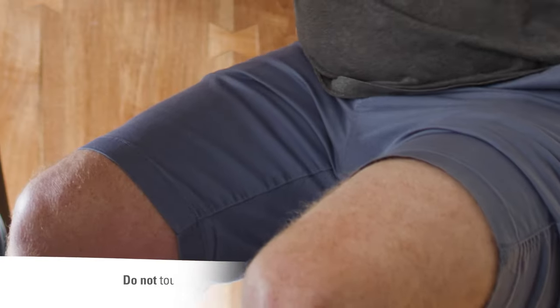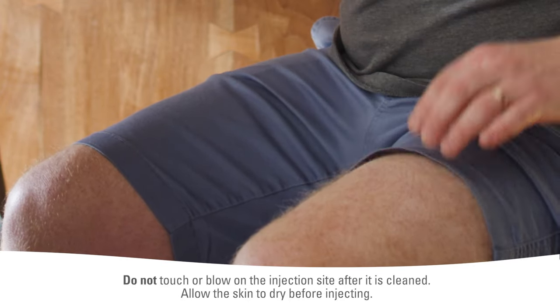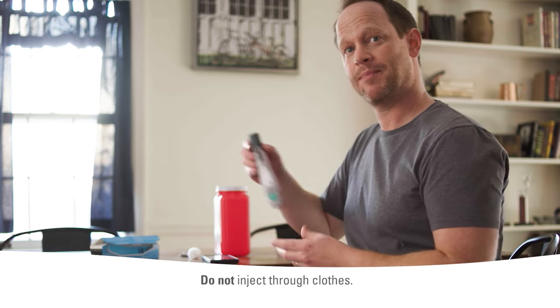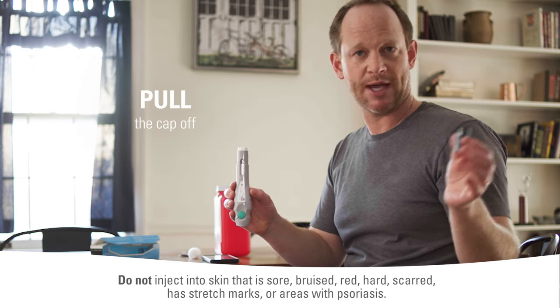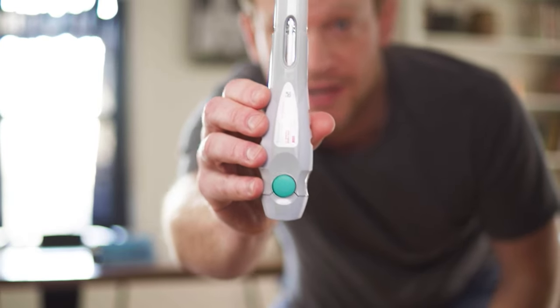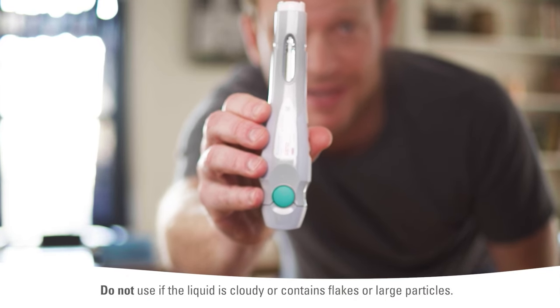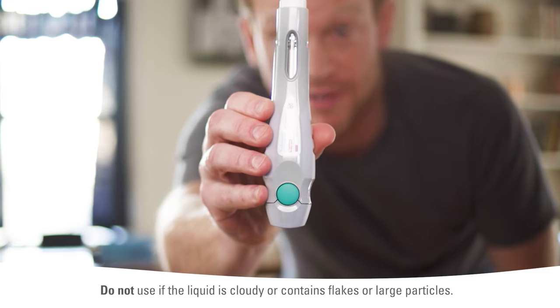Grab your alcohol swab and clean your skin in a circular motion like this, and let it dry. Now, I hold the pen with the dark gray cap pointing up. I pull the cap straight off and throw it away. Now, I check the liquid through the inspection window. It should look clear to slightly yellow and may contain tiny white or clear particles. It's normal to see one or more bubbles in the liquid.